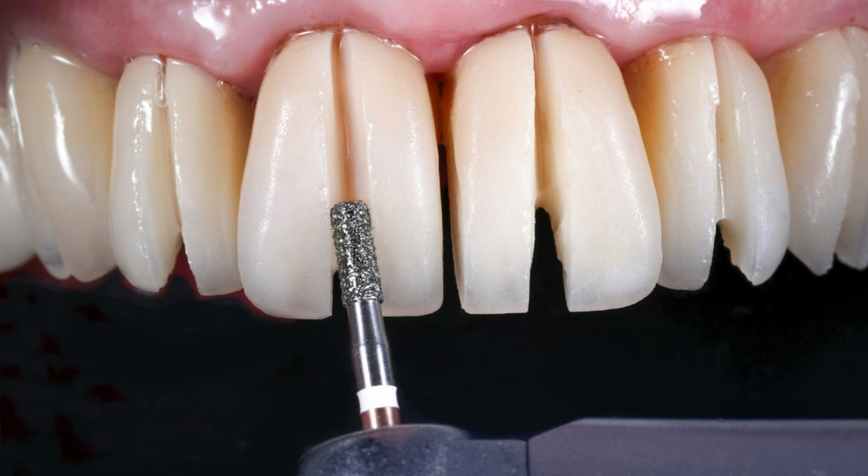So many of the people try to give angulation, saying that this much angulation should be there and only then the crown will retain. Usually I have seen in crown cuttings people give over angulations and more undercuts. So you have to try to reduce your undercuts, and the angulation should be a little bit of taper. It should not be like totally 30-40 degree taper. I've seen crowns like a mountain, and how can you expect a crown to be there for a long time, right? It has to be uniform.